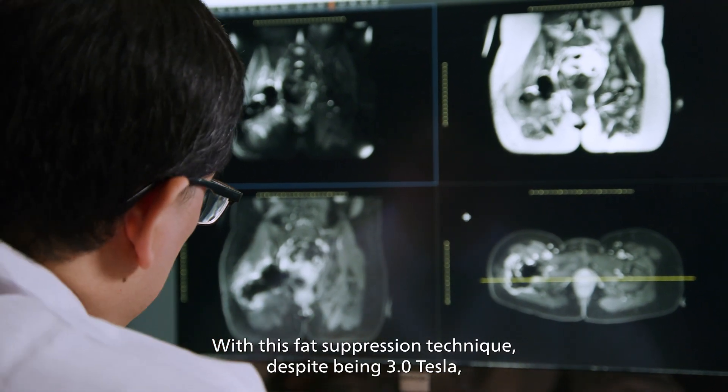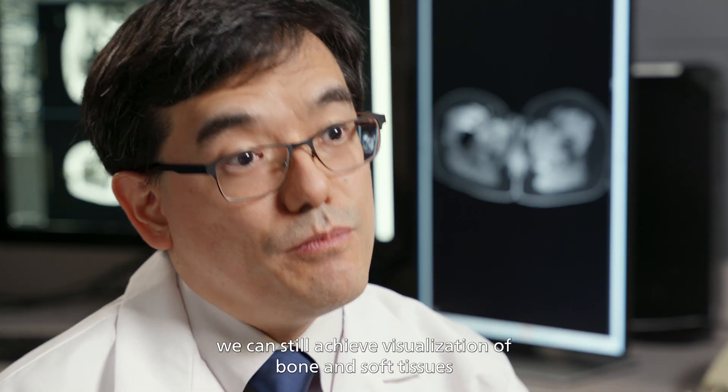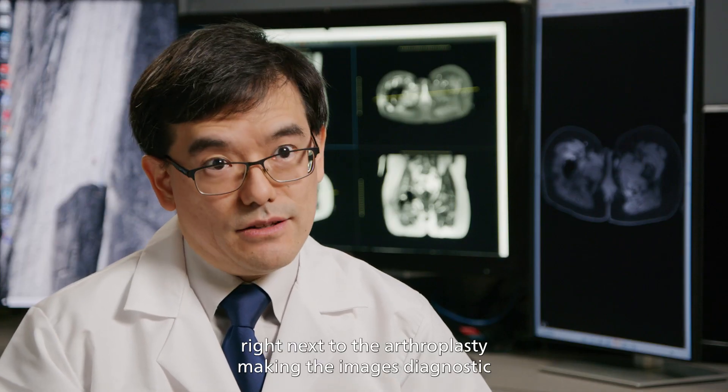despite being 3 tesla, we can still achieve visualisation of bone and soft tissues right next to the arthroplasty, making the images diagnostic and in a beautiful way.